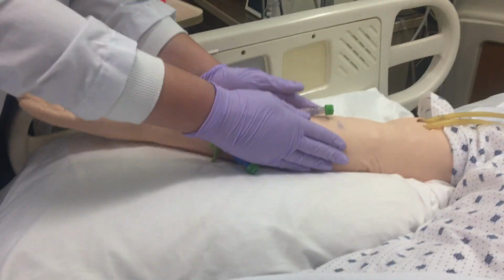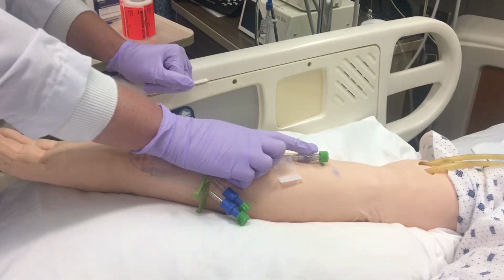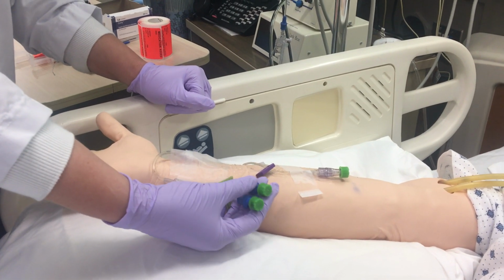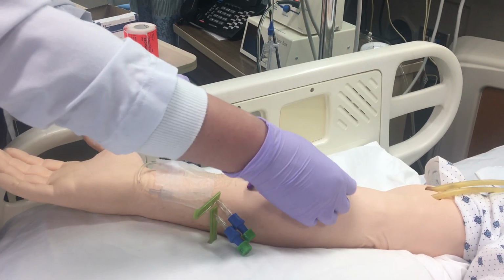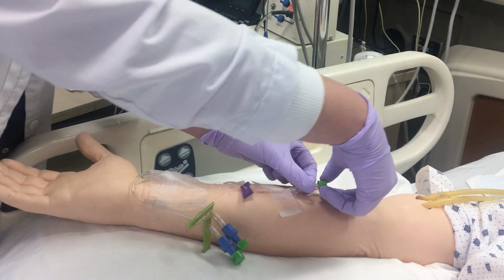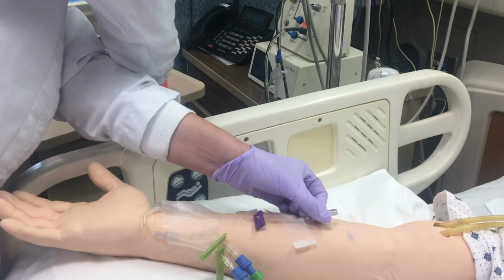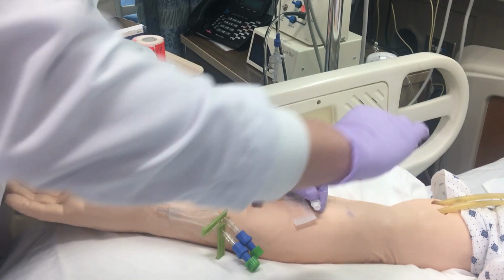And we are going to come to the IV site here. You can see there's a green cap. That green cap is a chlorhexidine cap, and you're going to see these utilized at many facilities. Maine General also utilizes these. When there's a green cap on the end of that port, you do not need to cleanse with an alcohol swab. That is per Maine General policy. So we're going to remove that green cap, and we're going to flush with 2 to 3 mLs of normal saline.